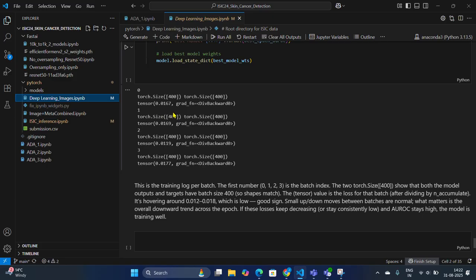Actually the training is very good regarding this analysis, and I did a few more analyses using GoogLeNet and others, but I was getting much lower accuracy compared to this, and this is the final thing. Thank you.